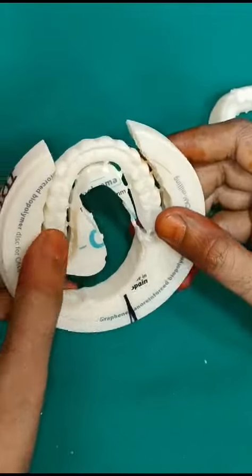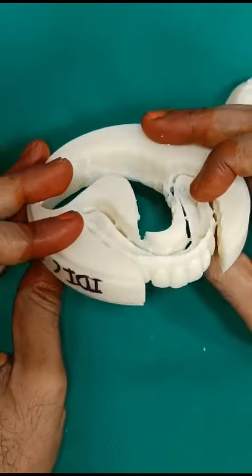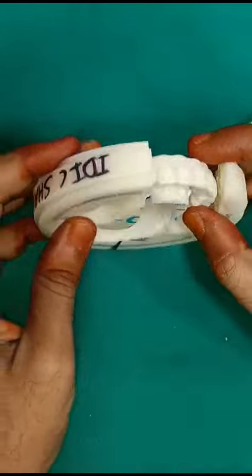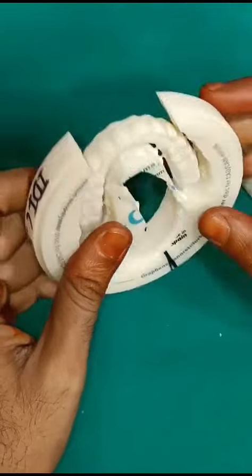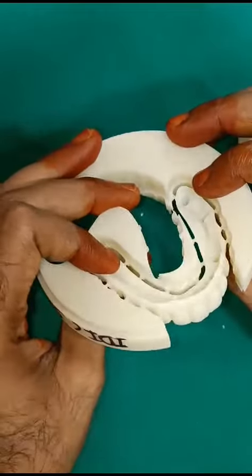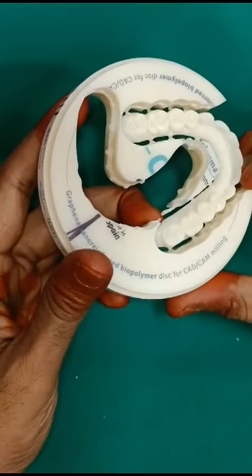Only for the upper can we use 90-degree milling to get the anatomical contour beautifully. This is an inbuilt problem in CAD/CAM milling. However, if you go for 3D printing it is not an issue — the contours will come out very beautifully. So only in the CAD/CAM machine do we need to apply this 90-degree milling to get a good anatomical contour on the labial aspect; otherwise we won't get it.